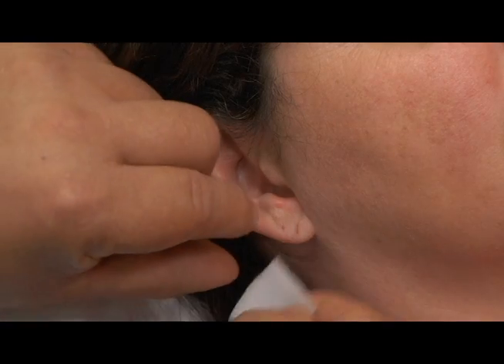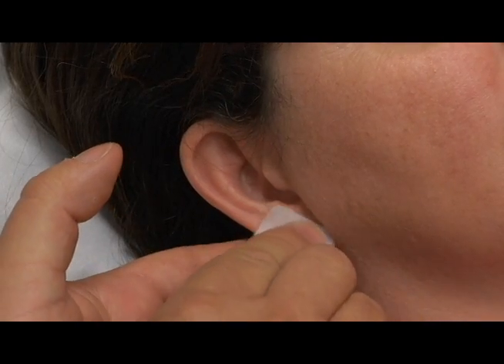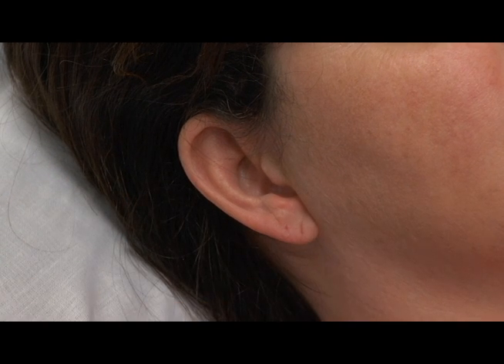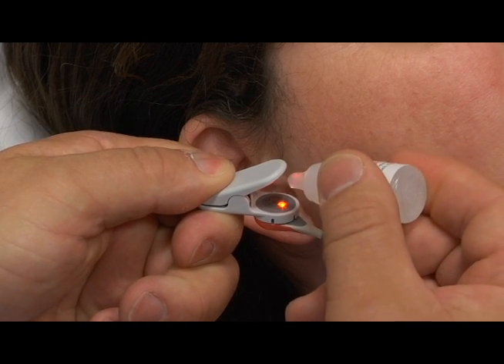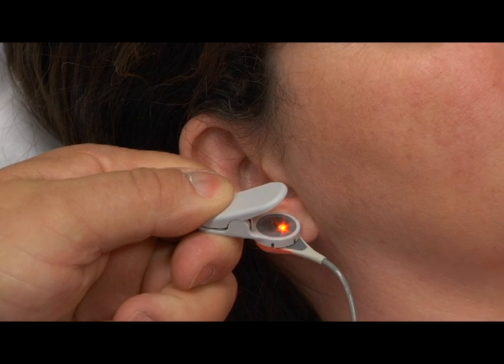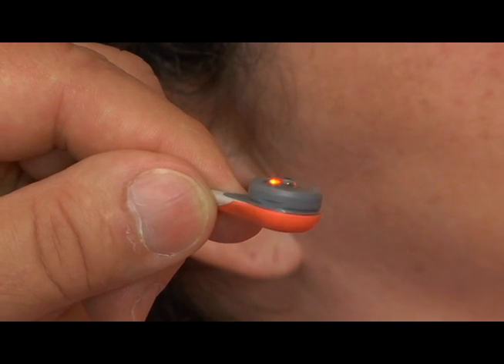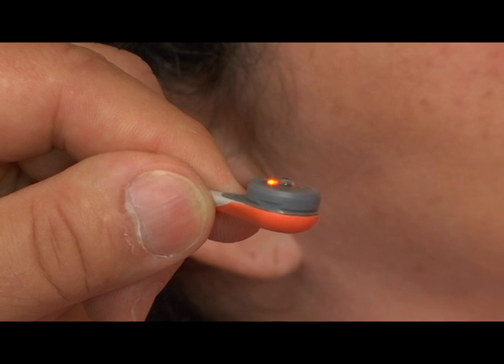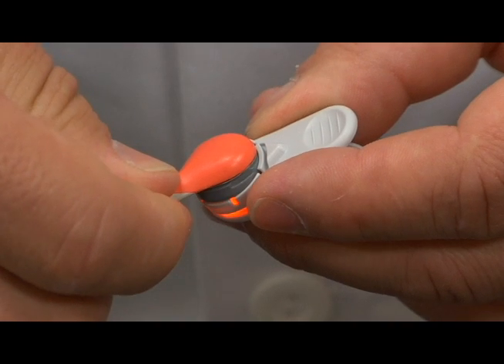Reattachment to the patient — Ear Clip: Clean the earlobe with a swab wetted with 70% isopropyl alcohol, or according to procedures applying to your institution, and let it dry. Place one small drop of Centec contact gel or water to the sensor membrane. Note that Centec contact gel works better for applications where the sensor is attached in a vertical fashion, as it is more viscous and water may slide off. Press the sensor into the ear clip until it snaps.